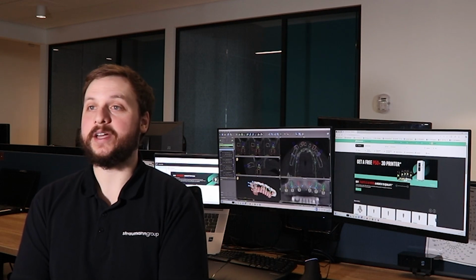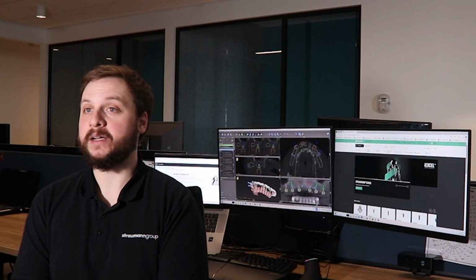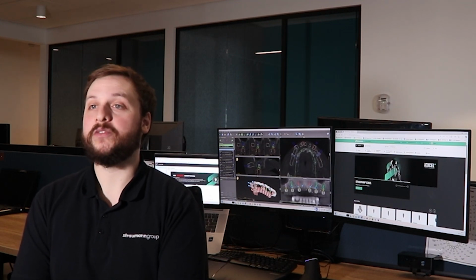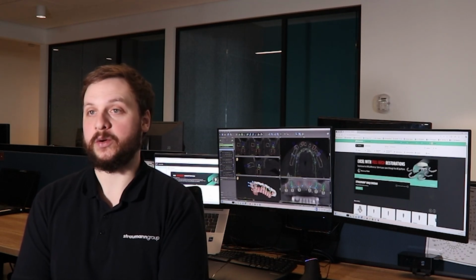Then a CT scan of the denture by itself is done. Both scans must be sent to the Smile in a Box team. To have more information on this process, please refer to our much more detailed scanning protocol to know more about the dual scan acquisition.